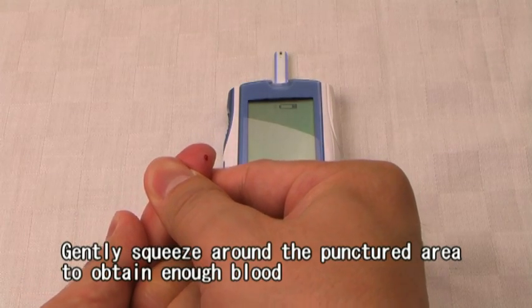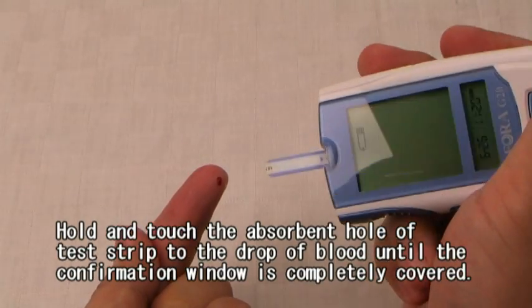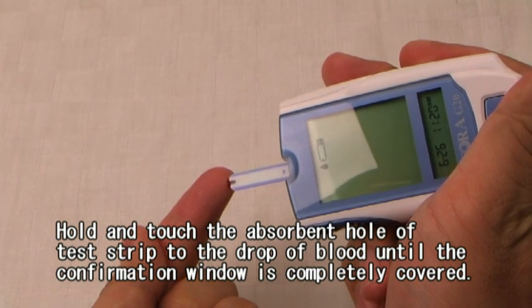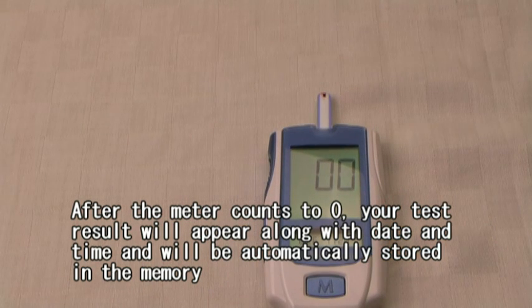Gently squeeze around the punctured area to obtain enough blood. Hold and touch the absorbent hole of the test strip to the drop of blood until the confirmation window is completely covered. After the meter counts to zero, your test result will appear along with date and time, and will be automatically stored in the memory.